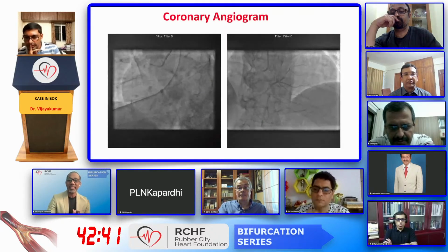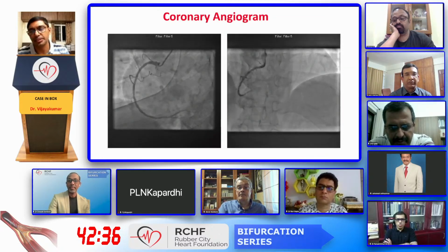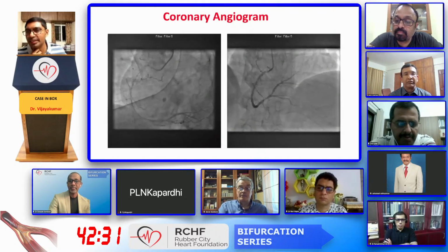What is your thought on this? Yeah, exactly. That is what our plan also is: prepare the LCX, do imaging from the LCX, and do imaging from the LAD, and decide on the stent strategy.